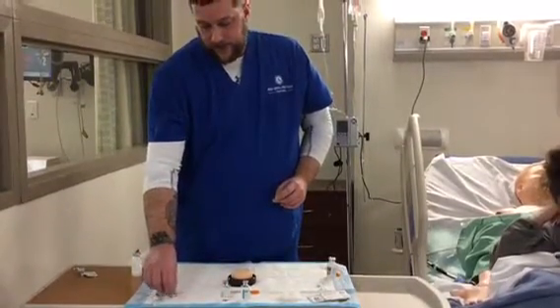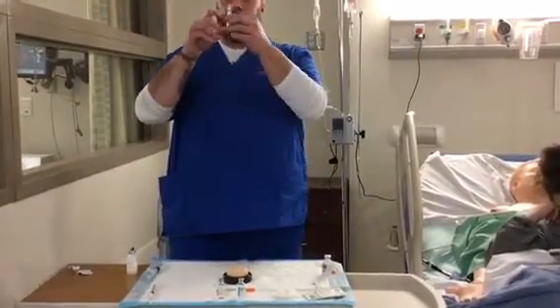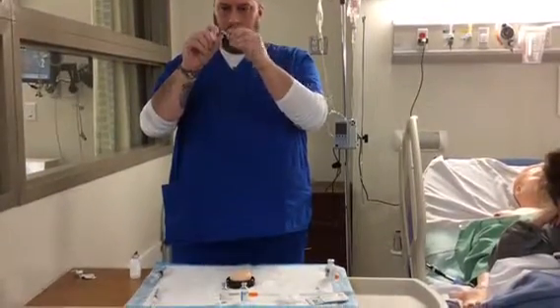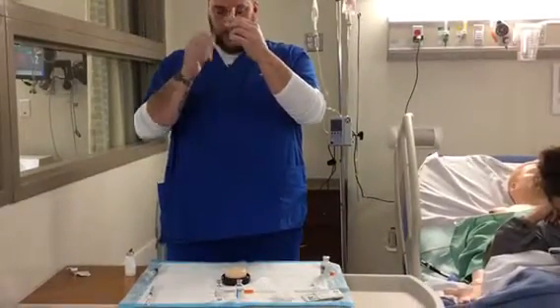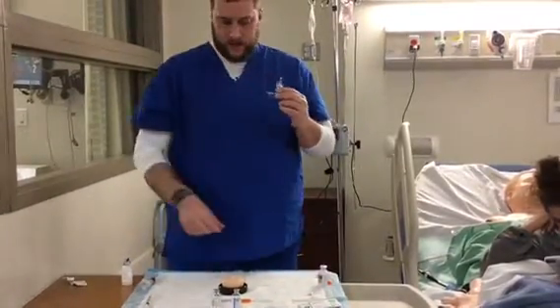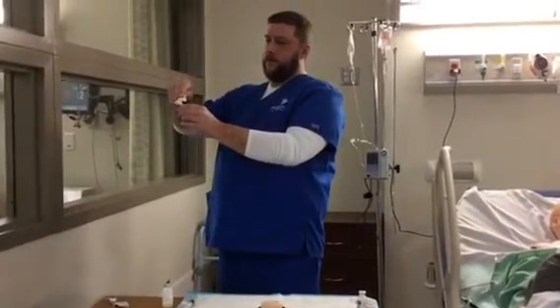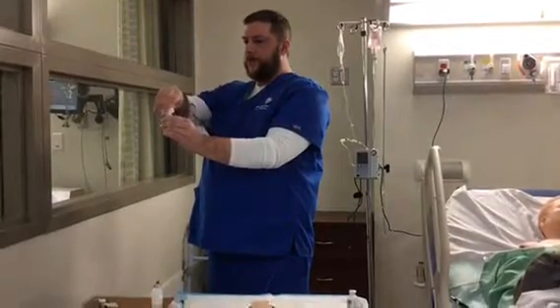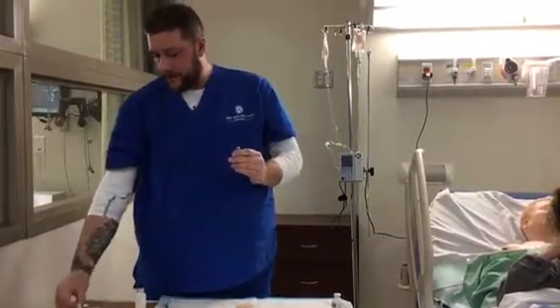And next we have the ampule. With this one here, we take the ampule first. You want to make sure that the medication is out. You can move it, and once it is completely out, you're good to go. Using an alcohol swab, I'll wipe around the edge, and using a gauze going against me, as to be careful not to break glass towards the face, I'm going to pull away from me and pop it. That would be discarded in the sharps container.